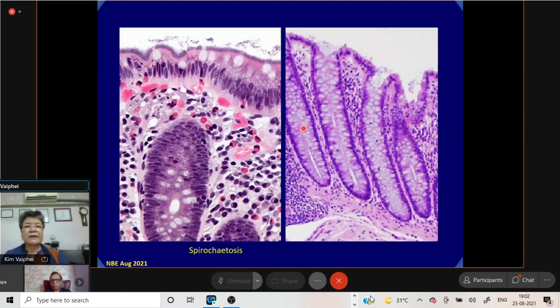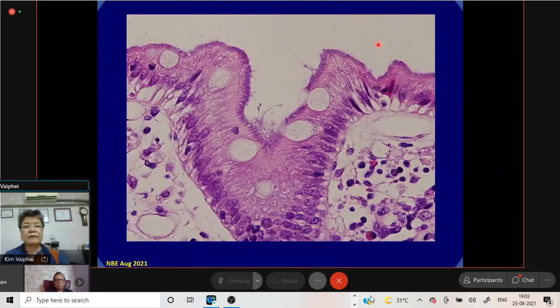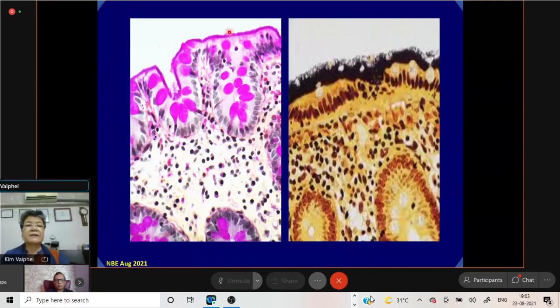And here, this is something which I don't know whether you all are aware of. This is around 5% of individuals. This is colonic spirochetosis, but many people can come with IBS-like pictures. This has to be picked up in a given biopsy because the treatment is very simple. And this is also another spirochetosis. And this is PAS positive, with the fuzzy margin, like a band or brush border. This is a fuzzy margin, which is highlighted very well on silver staining.